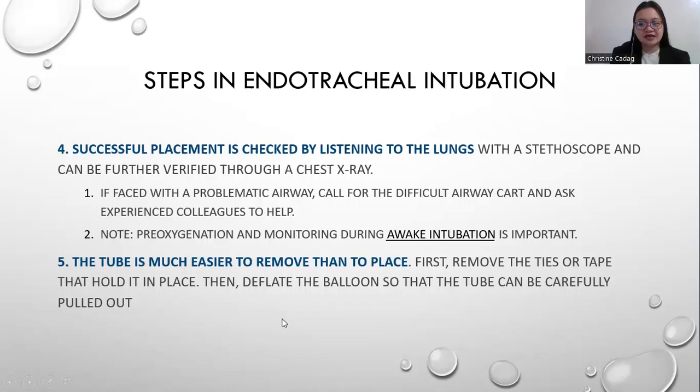So first, remove the ties or tape that hold it in place. Then deflate the balloon so that the tube can be carefully pulled out.